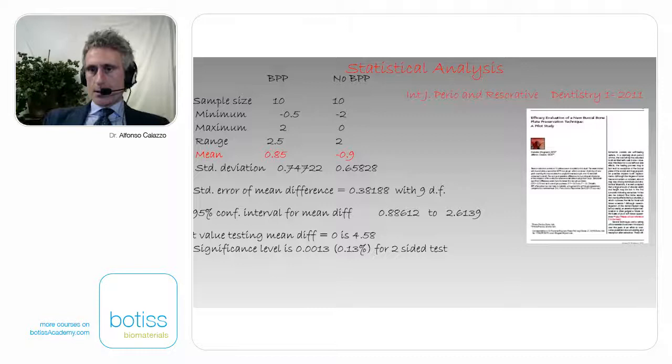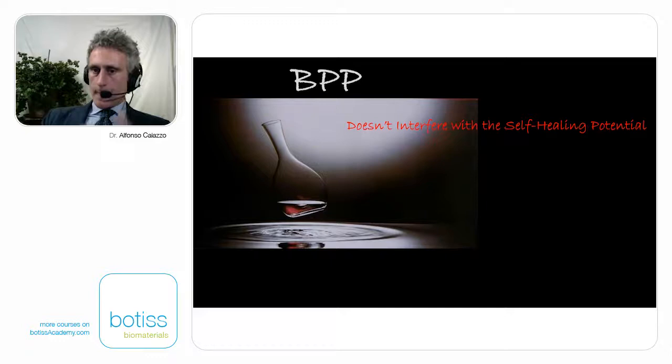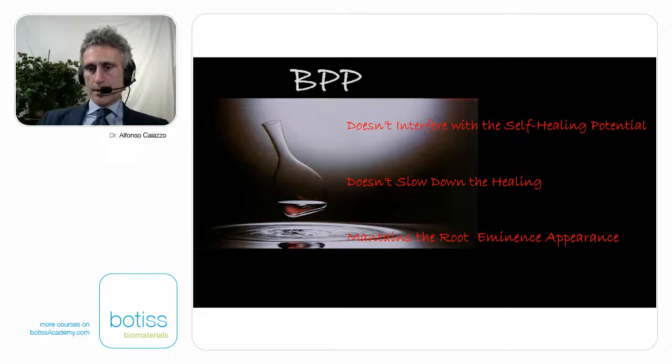We published the study in the International Journal of Periodontics and Restorative Dentistry in 2011. So as a conclusion, the buccal plate technique done at the extraction time doesn't interfere with the self-healing potential, doesn't slow down the healing, and maintains the root eminence appearance. So I answer the question I asked before. Is there a way? Yes, there is. And this is the way. Definitely this is the way. This is the new tool.